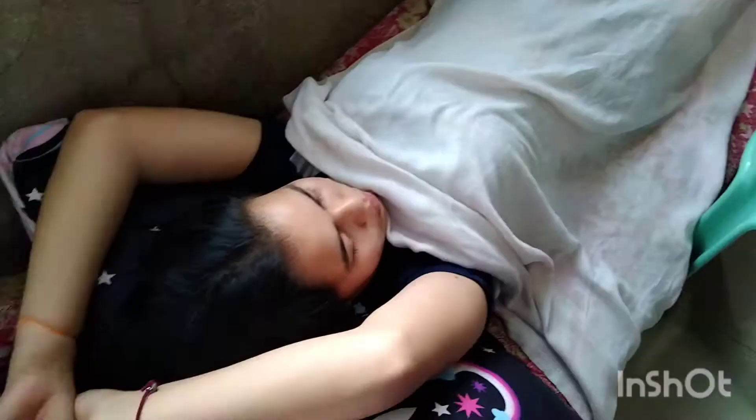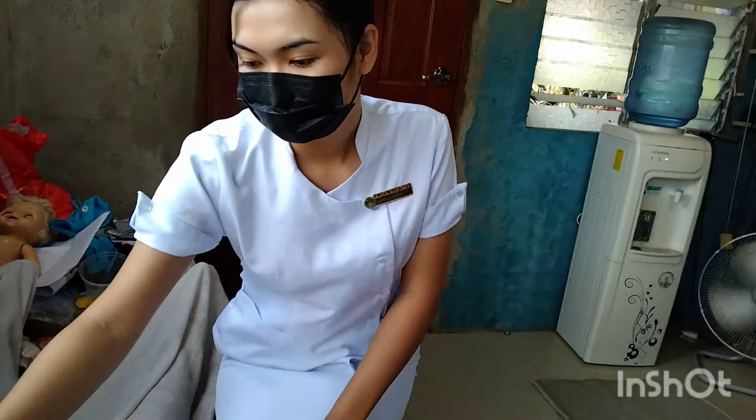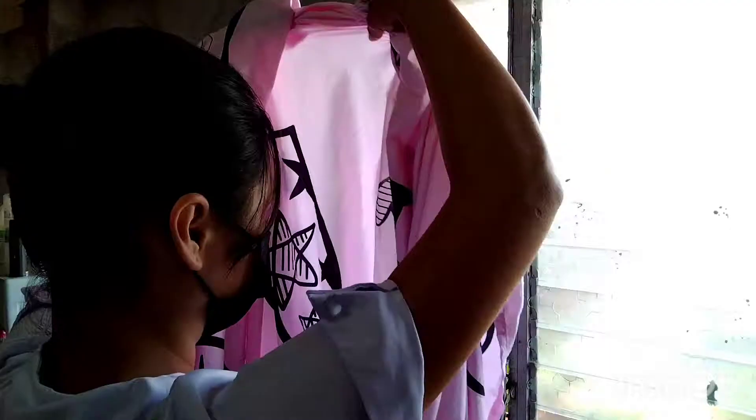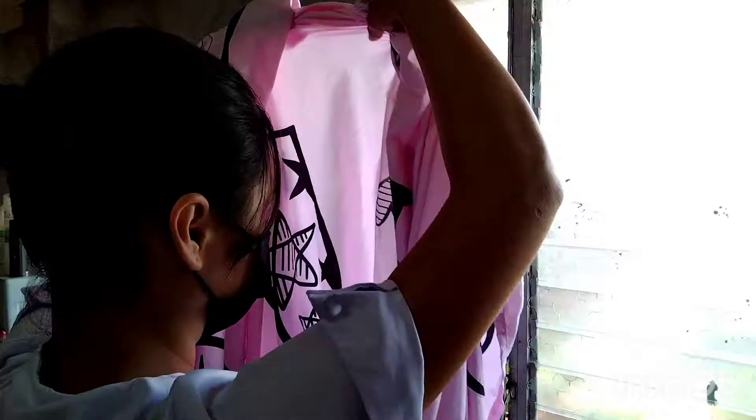Now proceed in preparation of the patient. Step number one is to identify the patient and explain the procedure, including the need for the patient to keep knees positioned during the procedure. Describe the pressure sensation that will be felt during catheter insertion. The patient will feel reassured if the procedure is explained and if handled gently. Next, place the patient in dorsal recumbent position if female, bringing knees up and out. This position provides good visualization of the urinary meatus and perineal structure.